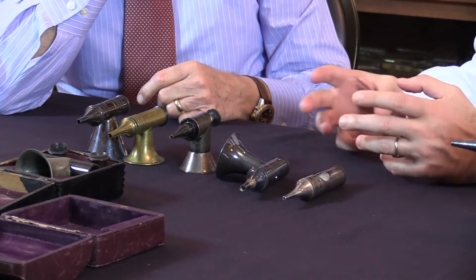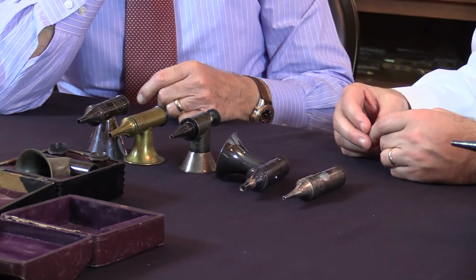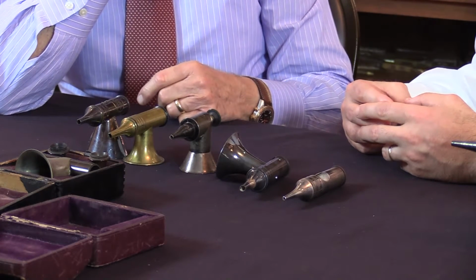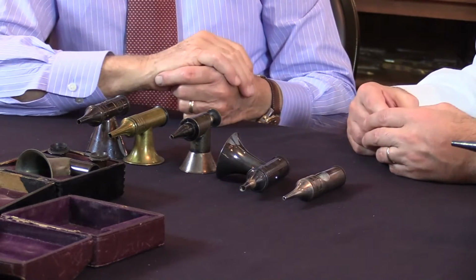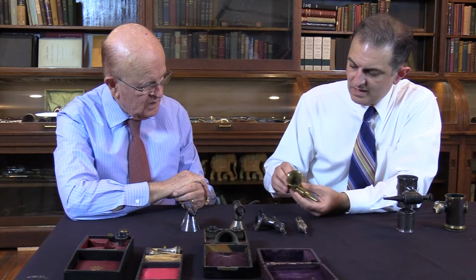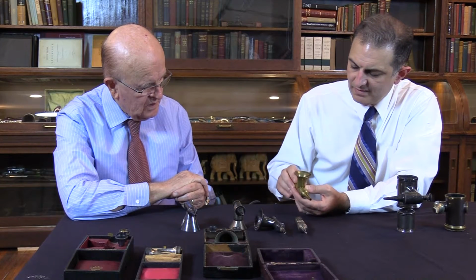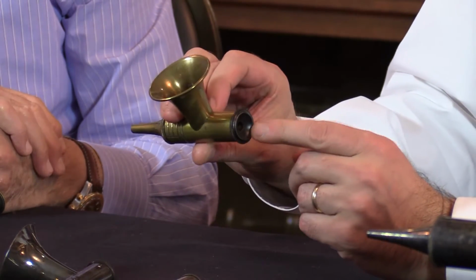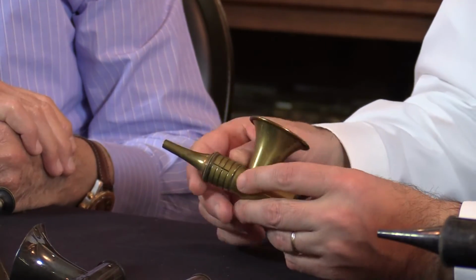So there were a lot of moving parts, and they tried to gather light. You still didn't really have an answer for man-made light. You had to use natural light. And so they started using mirrors and magnifying lenses. The Bruntons, which is probably one of the more common from this era, did that by gathering light through this side port and hitting a mirror at 45 degrees and reflecting the light forward into the speculum while the examiner would look through the eyepiece.